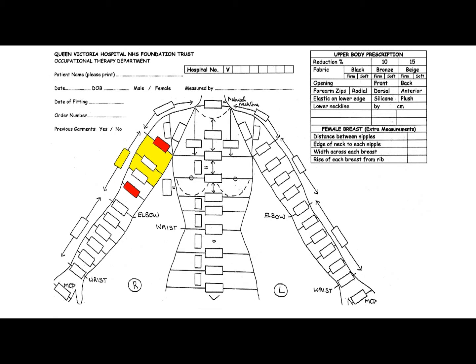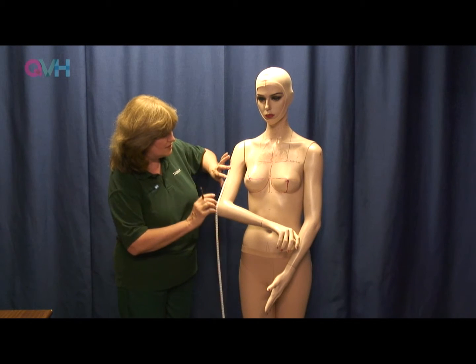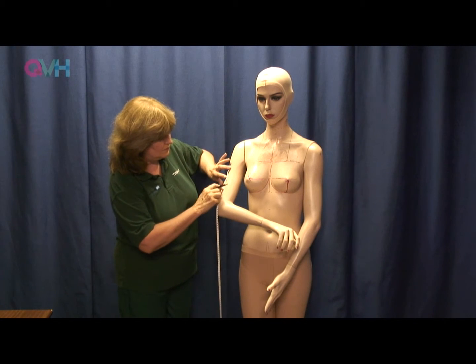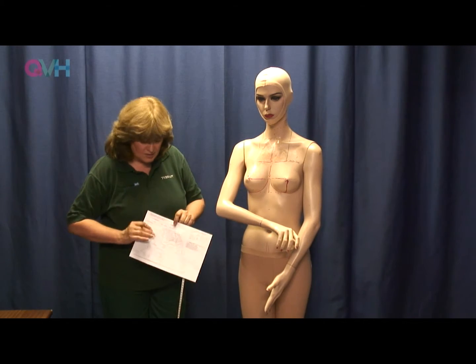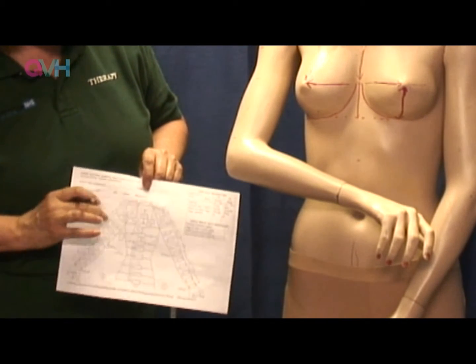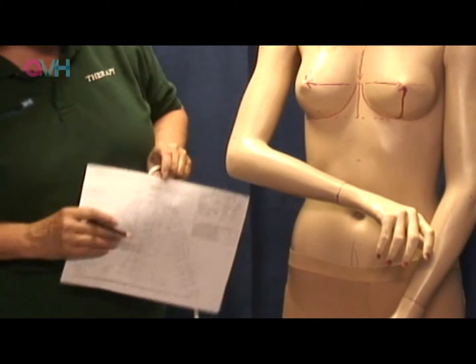So I would divide that 18 quite comfortably into 3 lots of 6. And then, having recorded the total distance on there, well, actually I'm going to record 666 because we haven't actually got the total distance.